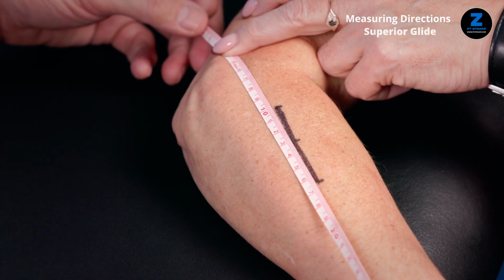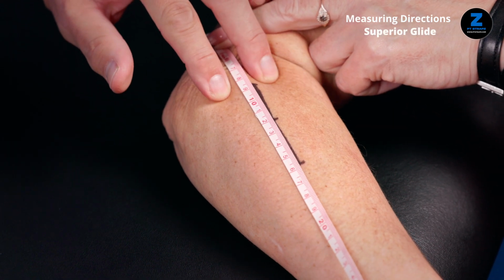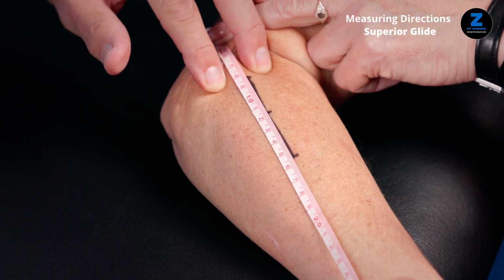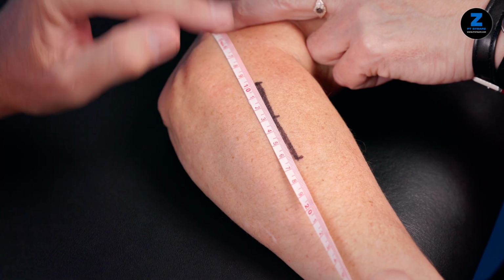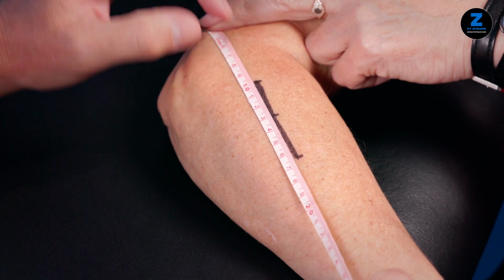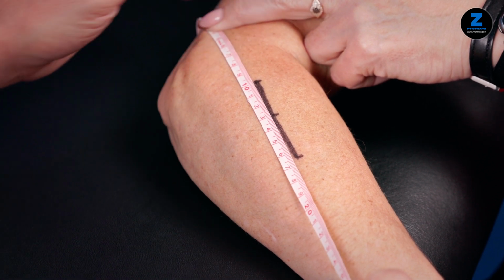And I want to pull it superiorly. That definitely goes to 2 centimeters. See how quickly I can go through this and measure the excursion for all 4 very rapidly, very quickly. So that's 2 centimeters for superior, 1.5 for inferior glide.